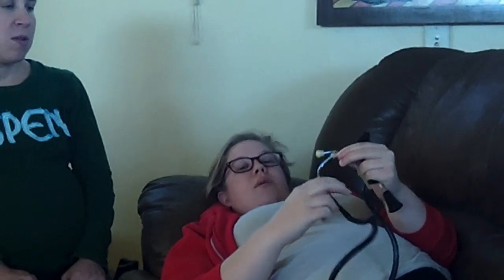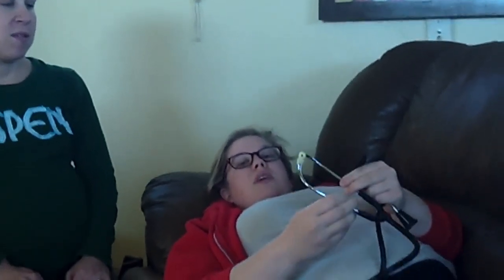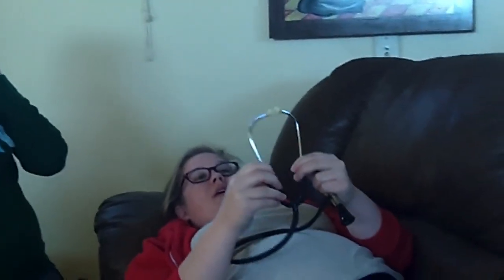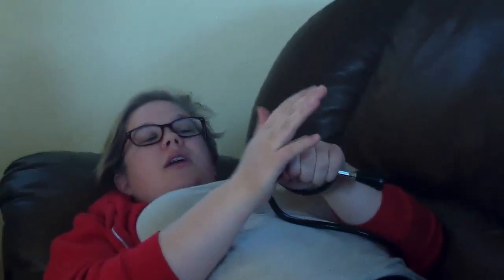So just to start with the basics, of course, these parts go in your ears, and really the most comfortable way is they're sort of angled. If you point the angly bits towards your nose, that's what we decided, right? So once you put these in, then you're hearing the amplified sound from this end. So this is the spot that you're going to put on your belly, and this really is designed for a forehead, like so. So you're sort of like a unicorn, but since you're listening to your own belly, you're going to be using just sort of the flat of your hand.